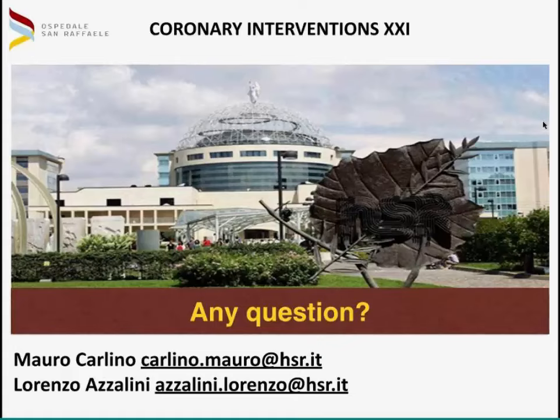One more question is regarding the guide catheter size. You still use 8 French for this to make it easier. Is there any particular preference you have in terms of guide catheter size? It depends on your setup. Usually I use a 7 French in order to reduce the amount of contrast with the antegrade injection. But of course, if you use 8 French, there is no problem. I think it's not a matter of the French size of the guiding, but the correct step-by-step procedure. If you are well aligned with the artery, and if you perform this maneuver at the correct time, I think that having a 7 French or 8 French guiding catheter doesn't matter.